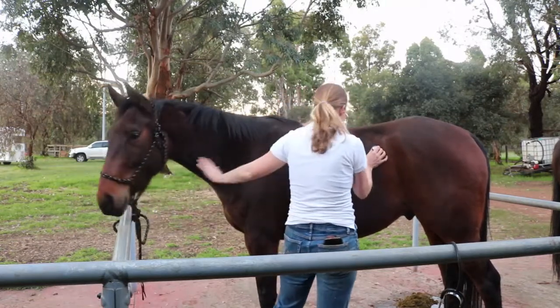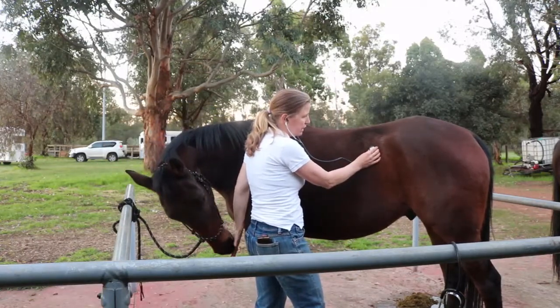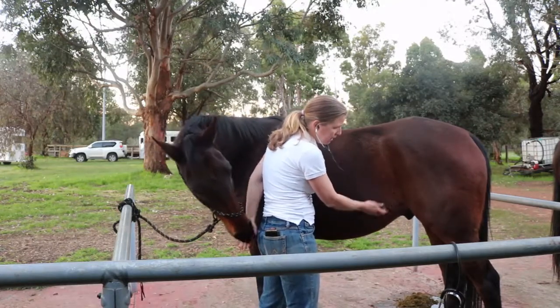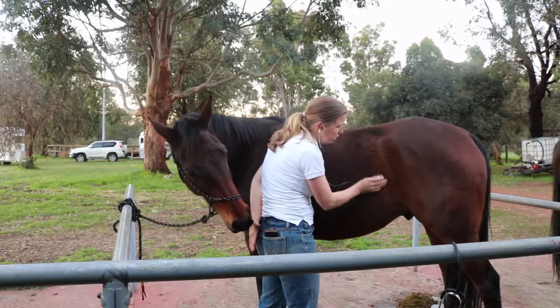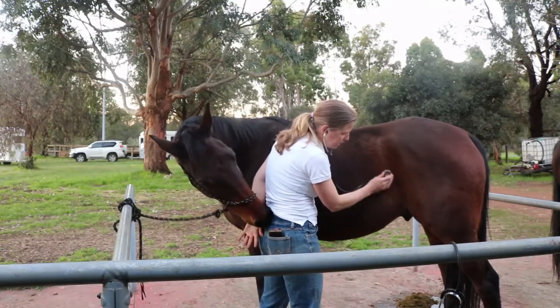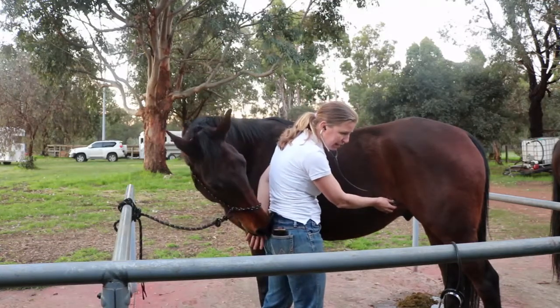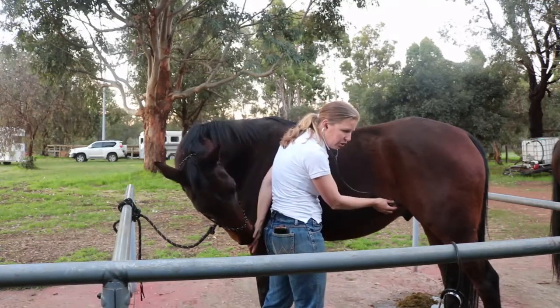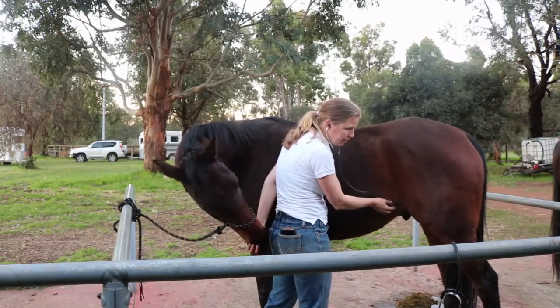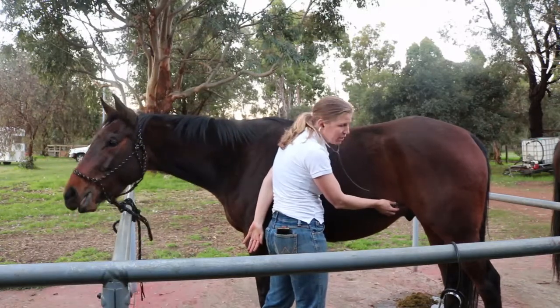Once I've heard some really good gurgling sounds, I move on to the next spot. For the lower quadrant, I always run my hand down first so the horse doesn't get a fright or feel suddenly ticklish. I hold the stethoscope there and listen for those nice loud gurgling and toilet-flushing sounds. There's lots going on right now because it's dinner time.